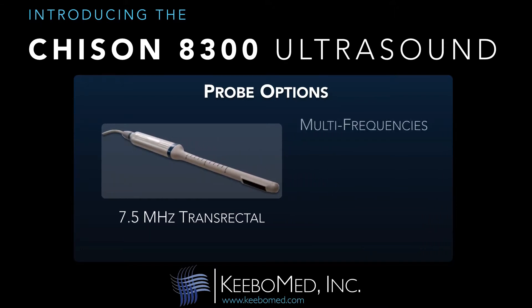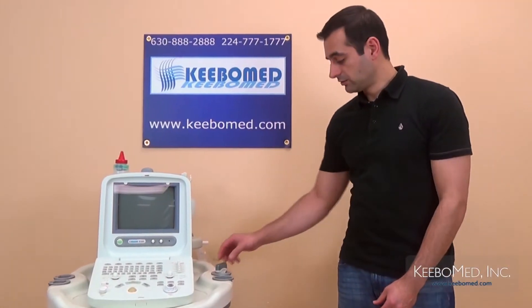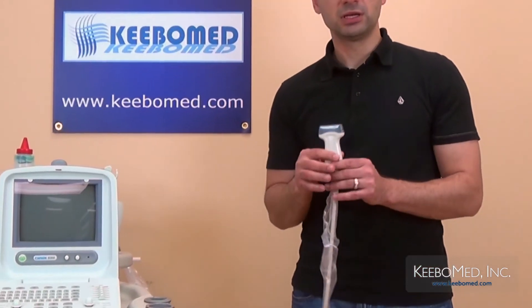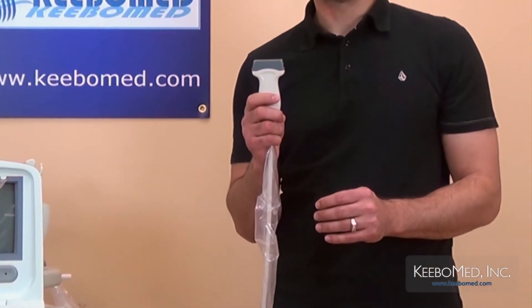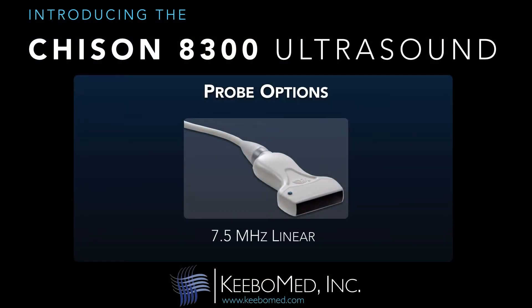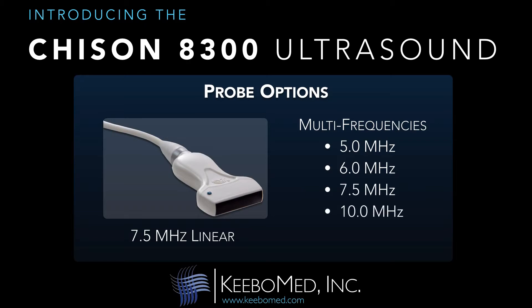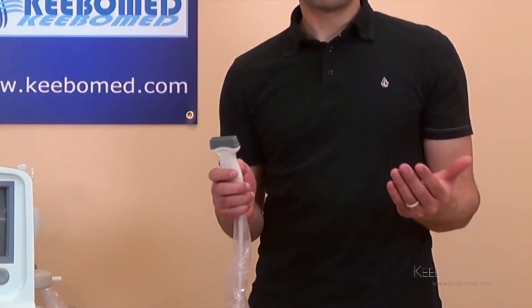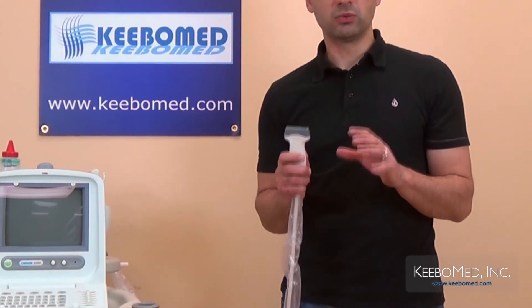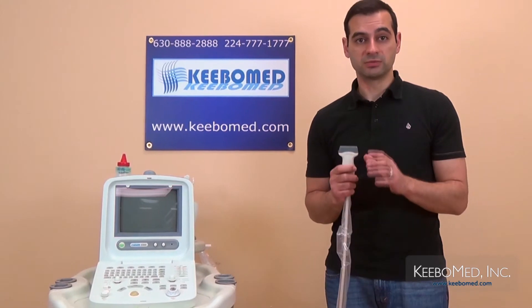The transrectal probe has multi-frequencies of 5, 6, 7.5, and 10 MHz. With these probe options, the 8300 can be used for a wide range of applications, which really allows doctors to get the most from this system.